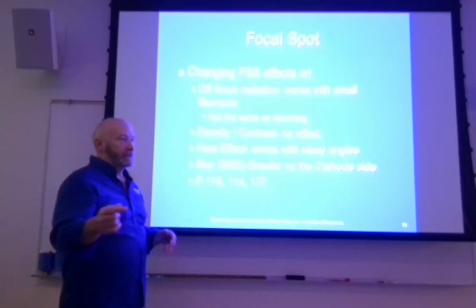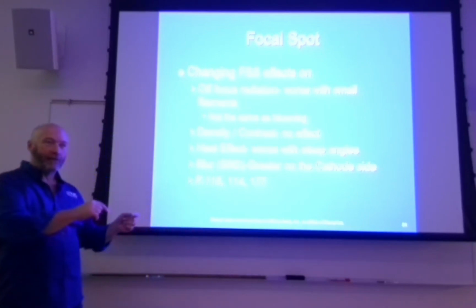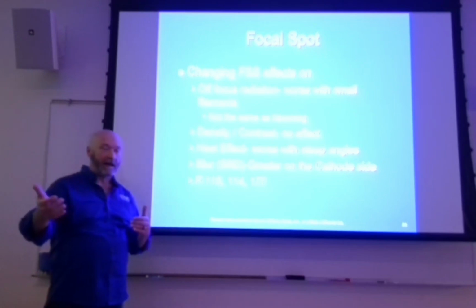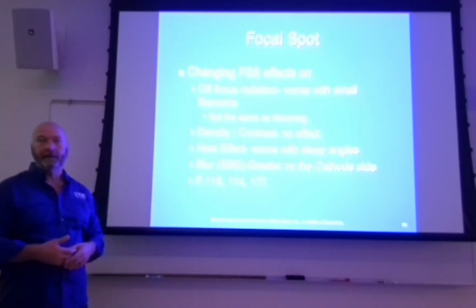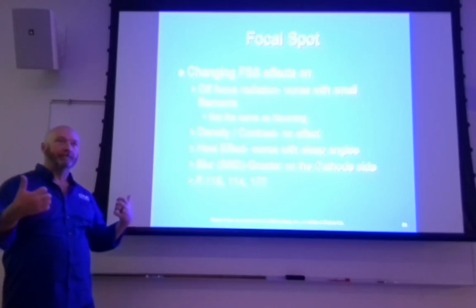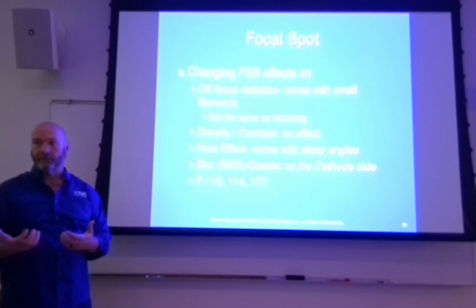The thing that's going to catch you though is that you're going to equate that with, well, I can't make an exposure of 100 mAs on a small focal spot, which some machines, especially if you select a high mA station, will disallow you from making that exposure. That's not the same thing, okay? If you can't make the exposure, you can't really compare two exposures.